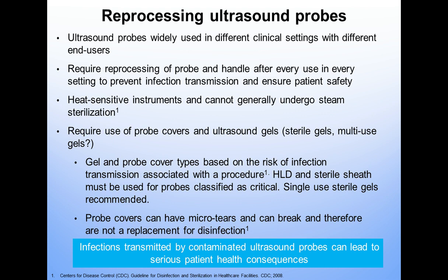And with regards to gels, there's been a lot of documentation over the last 15 to 18 years on the risks of using multi-use gel containers. We recommend in Newfoundland and Labrador that you use single-use sterile gel. You don't use a multi-use gel container.